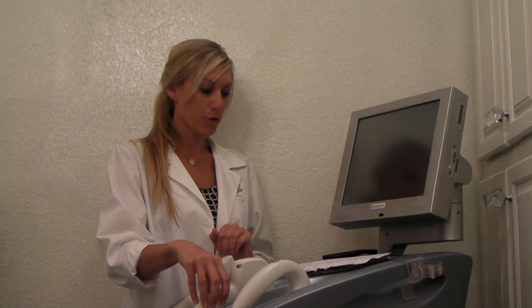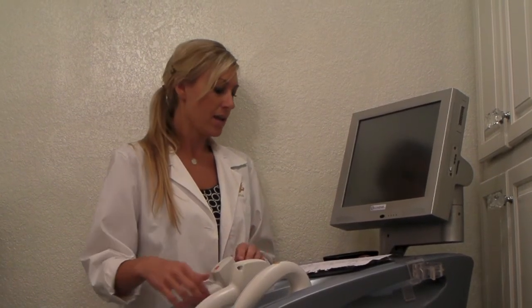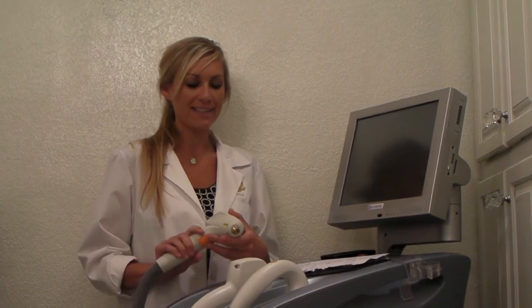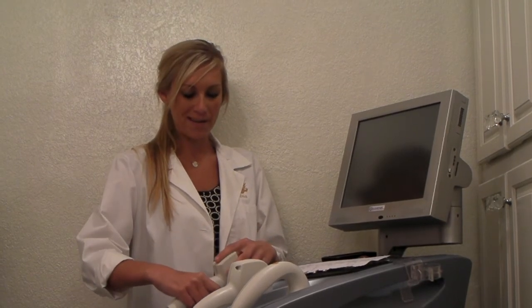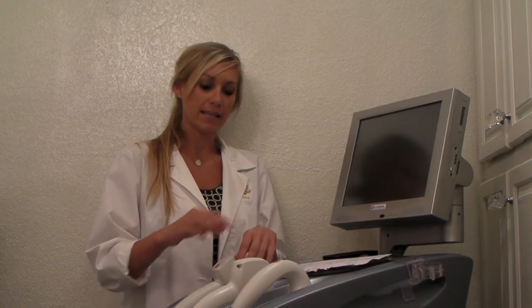Sunscreen, again, is very important. No heavy sun exposure, no tanning beds, and moisturize. The YAG for spider veins is done probably less frequently than the others, because most of the spider veins, whenever people come in, they're not actually spider veins, they're palpable. So anything that you can feel, if you run your finger across the vein and you can feel a raise in the skin, that means that we can't treat it with the laser.